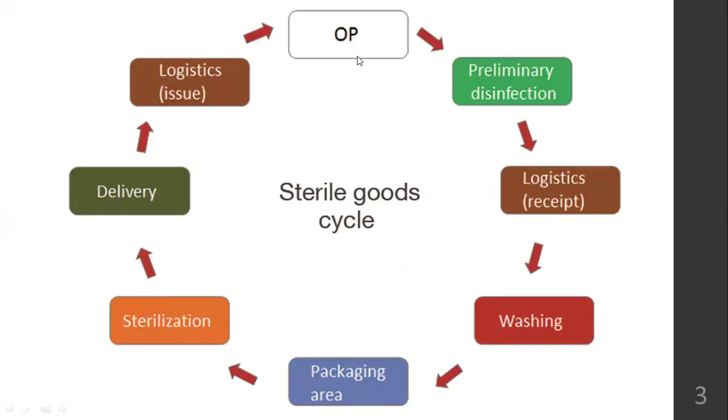For example, if it is an operation theater, or outpatient department, after using it on the patient, any article that has been used on the patient, preliminary disinfection will be done. Okay. First thing is the preliminary disinfection that they will do, and then that is decontamination. Okay, and they will send it to the CSSD.